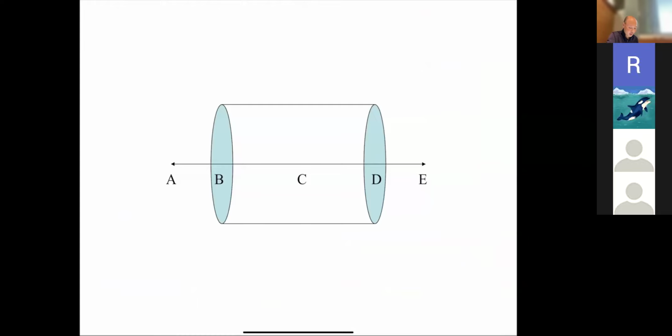Okay, so we're going to do a little thought experiment here. We're going to pretend you took this course, but you ignored everything I just said, and you walked into the magnet room carrying this big piece of metal. We said that this metal would be ripped out of your hands and sucked into the magnet, right? So the question is, let's say it's ripped out of your hands at point A. What happens next in time? How far is this metal going to go through? Any thoughts on this? Is it going to go to point B, point C, point D, or point E?